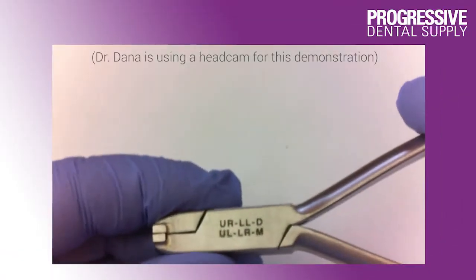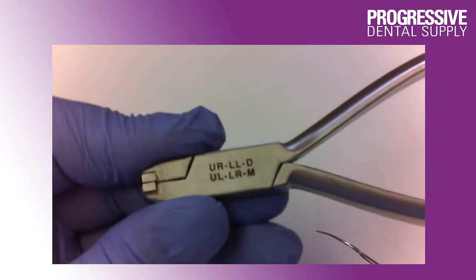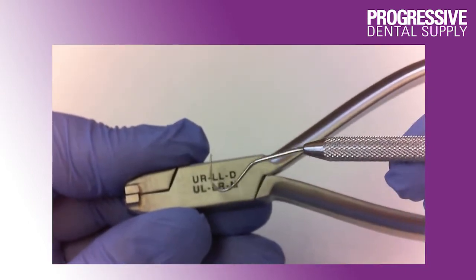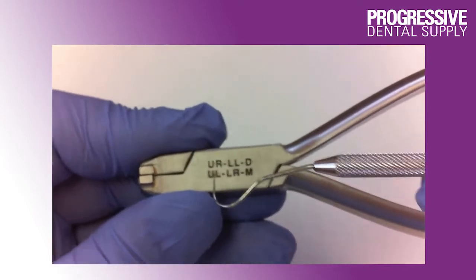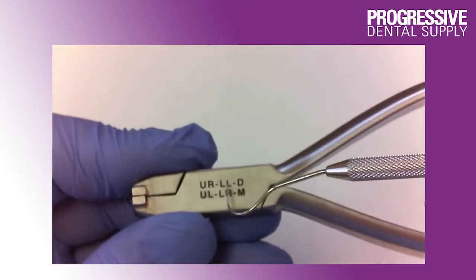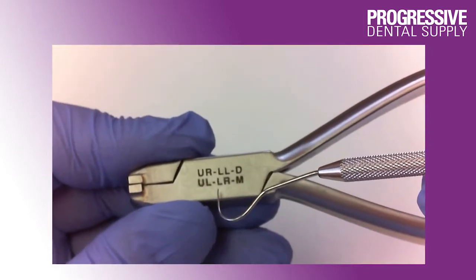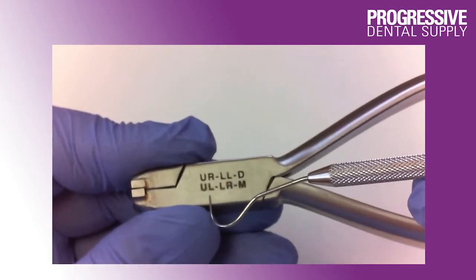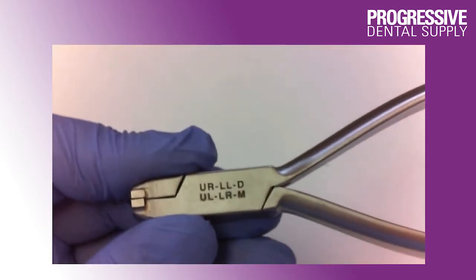Now let's look at how the pliers work. As you can see, the pliers have markings telling you what quadrant and what direction the bend will be made in. In this particular plier, the upper right and the lower left will get a distal root tip bend, while the upper left and the lower right will get a mesial root tip bend.